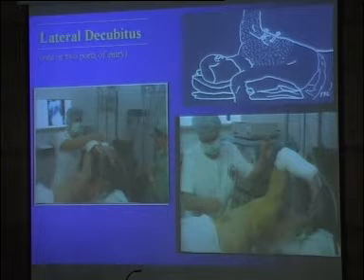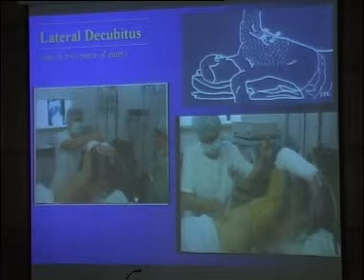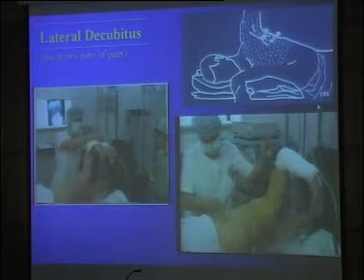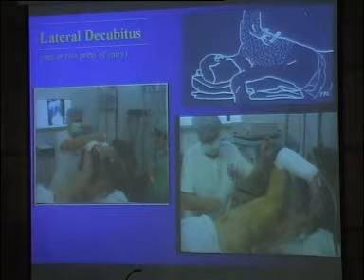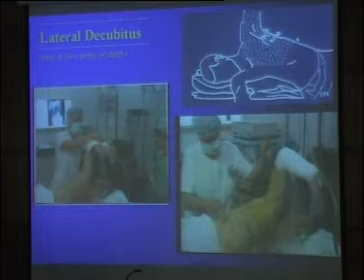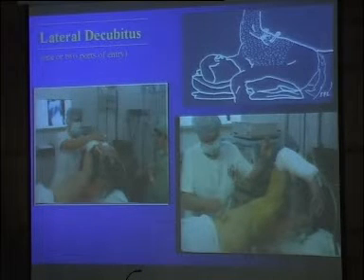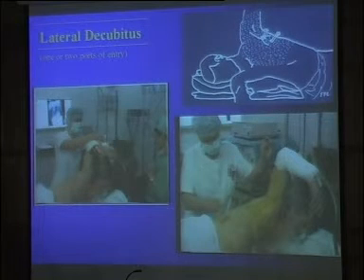The patient position is lateral decubitus, as you can see here. It's our former facility. We have a new facility since last week. Very nice facility. And as you can see here, I put 2 points of entry. It's not necessary: 99% of the procedures are performed with a single point of entry. Just to show you, for pleural effusion, usually we choose, it's an important message, the fourth, fifth, sixth intercostal space on the middle axillary line. And for pneumothorax it's a little bit higher. It's the third or fourth intercostal space, same middle axillary line. Okay?